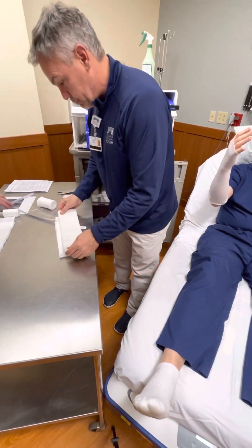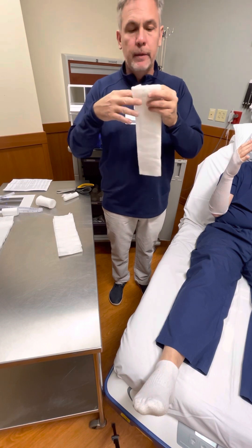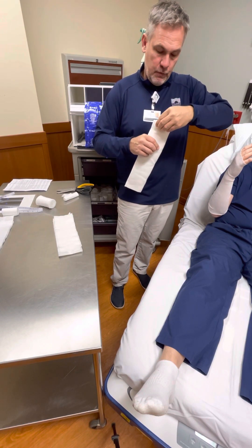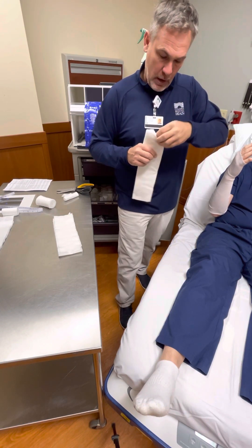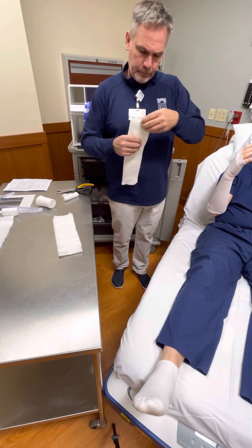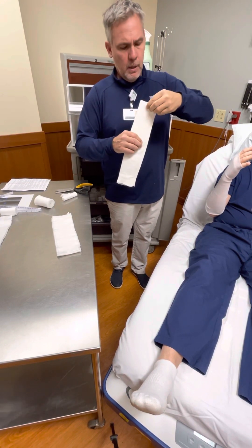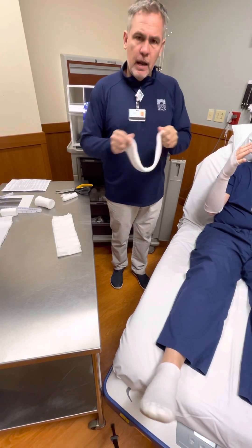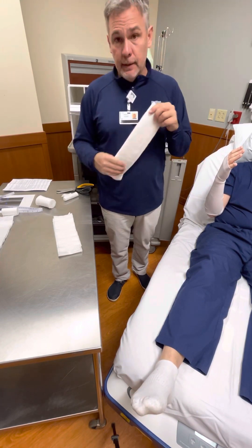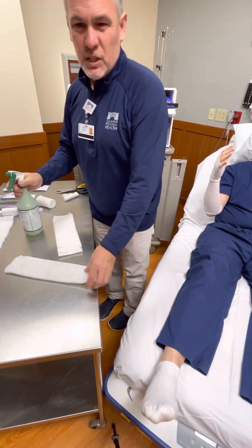When I pull this out, sometimes one end is really hard - take that off and don't use that hard end. What I always do is pull these ends up because this is going to turn hard like a little saw blade, so cover that saw blade at the end. Hold on to it in the middle, pull it up - that saw blade is covered. Now you have a lot of time to work with this. Don't panic just because you pulled it out. Once you spray it, you have probably about eight minutes before it starts hardening up to the point where you just can't move it anymore.